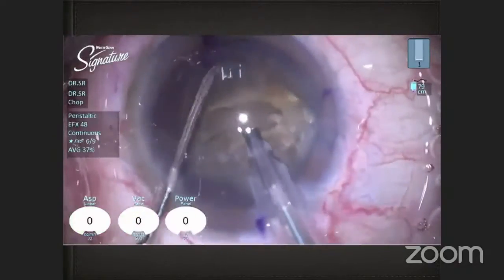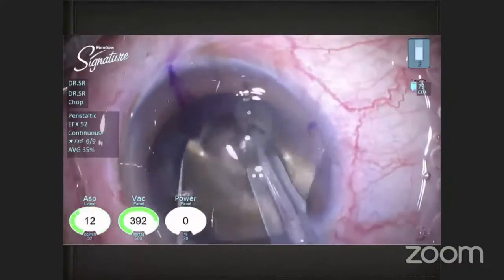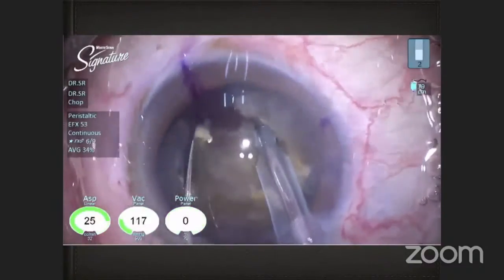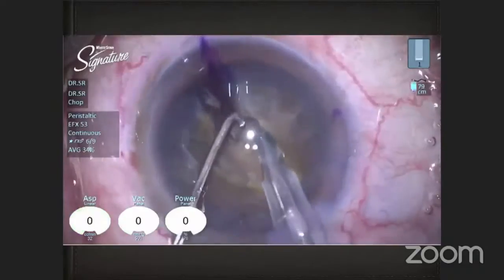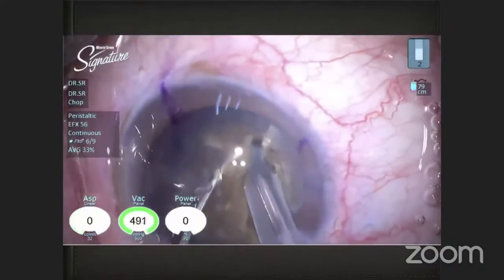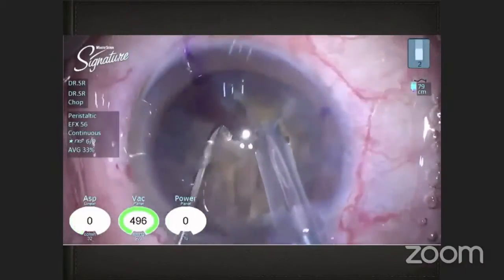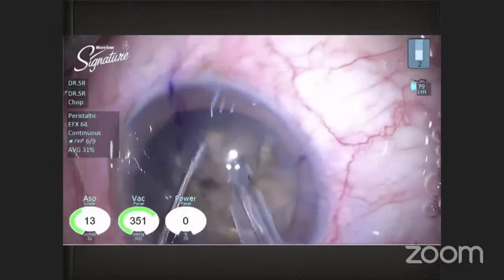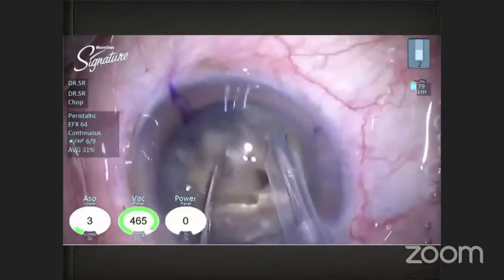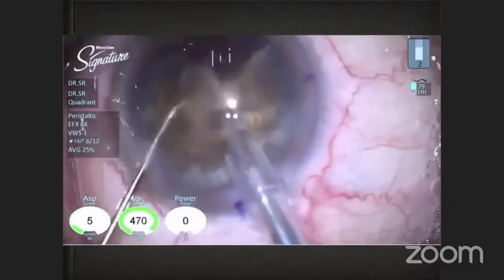Now, this chop in these hard cataracts, because you don't want too much lateral extension, may not go right across to the entire extent to the other end. So rotate the nucleus by 180 degrees and then go on to chop at a deeper level till the central spine is broken down. Again, you can do the same things, occlude, and again, keep chopping. As you can see, I keep going deeper and deeper till it is chopped right up to the center. Traditionally, this is what is referred to as multi-level chopping. You start a little more superficial, but keep going deeper till you're right up to the base.